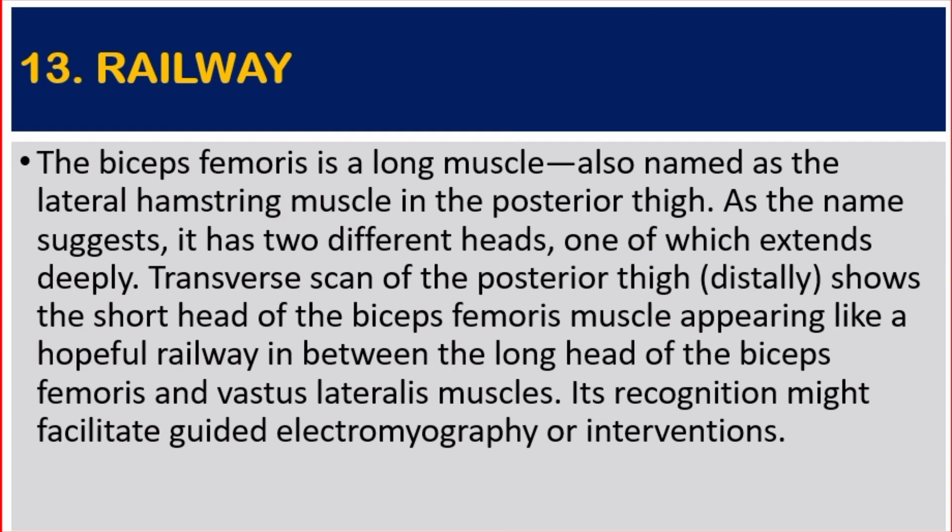Transverse scan of the posterior side shows the short head of the biceps femoris muscle appearing like a hopeful railway in between the long head of the biceps femoris and the vastus lateralis muscle. Its recognition might facilitate guided electromyography or interventions.